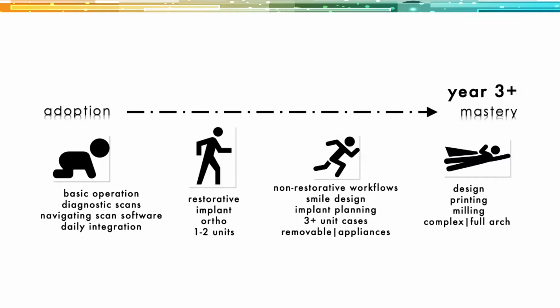Basically, go through the crawling phase, adopt the intraoral scanner, use it for diagnostic scans, use it at your new patient visits, really integrate it into your daily workflows and your daily habits and routines with you as well as your team. And as you get going, start off with the walking phase, really doing 1 and 2 units, kind of simple cases to really get an idea of how the technology works and what are some of the limitations that you're going to experience inevitably as you get started with new technology.